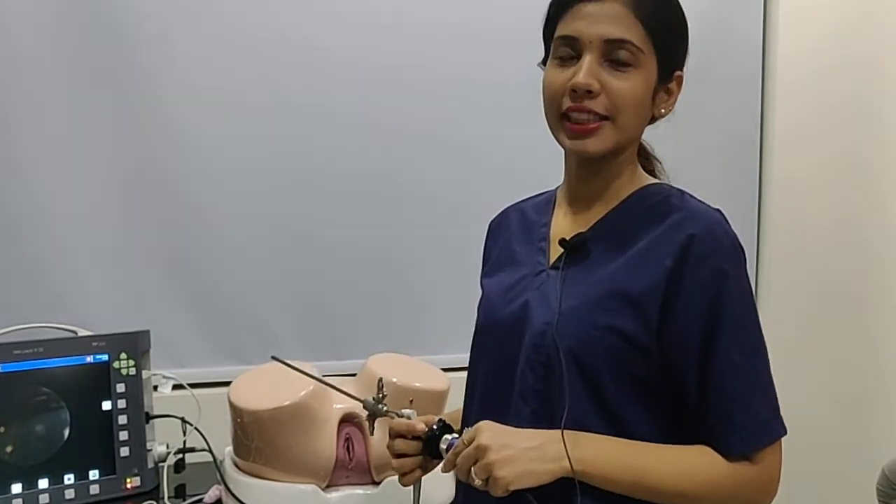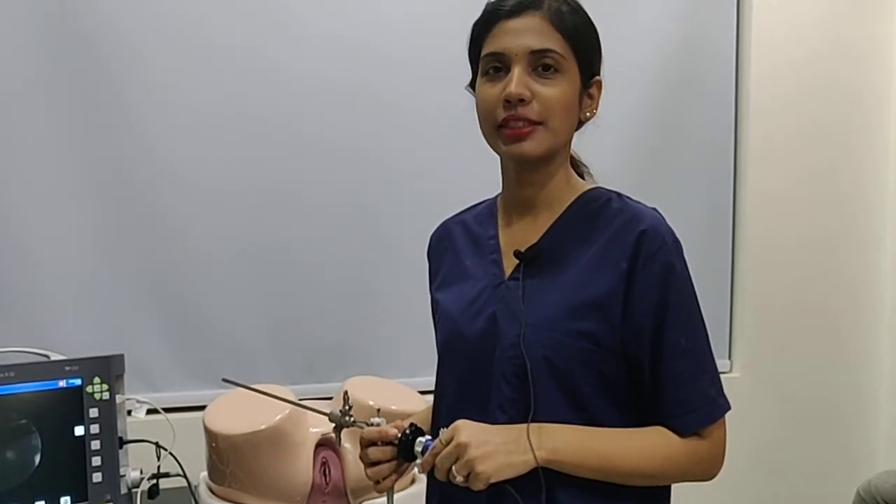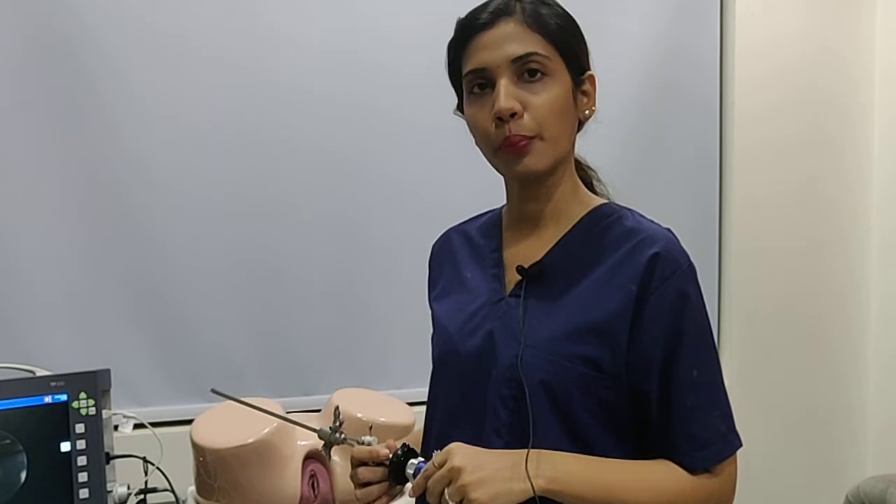Hello everybody, this is again Dr. Garima Shrivastav from Orange Clinic and Shree Mist Delhi. Continuing with our series of Hysteroscopy Made Easy, we continue with our vaginoscopic approach with the practical demonstration.